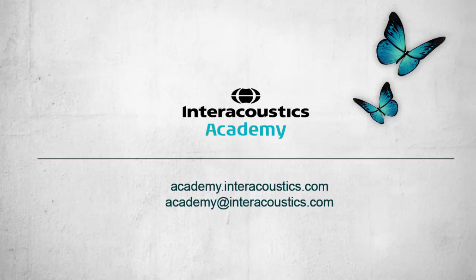Okay, we have one last question. Thanks for the presentation. I am currently a second year student at UQ, and I remember hearing that patient fatigue could be an issue with cVEMP testing. How would you address this if you need to take several approaches to testing, i.e. frequency and threshold? That's a very good question, and patient fatigue can cause a problem for us clinicians, especially if the patient is older. They aren't able to do the tests very well, or certainly not many times anyway.